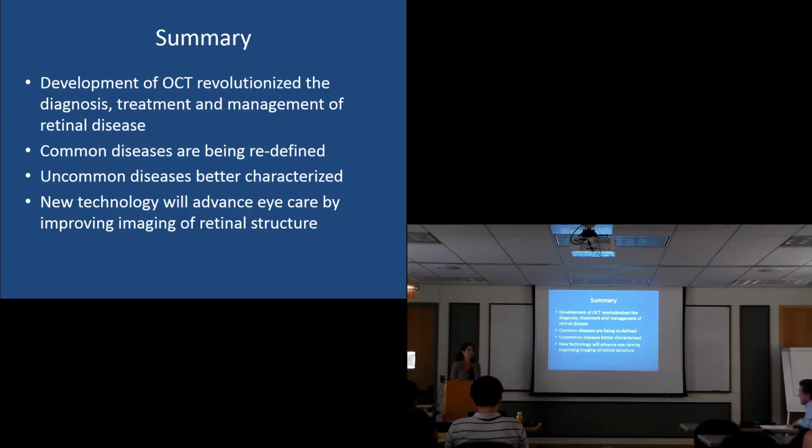So definitely a lot of research, a lot of excitement with it. But even very prestigious universities who don't have access to the technology are just looking to the OCT instead, trying to make that C-scan image replace what the adaptive optics would do.